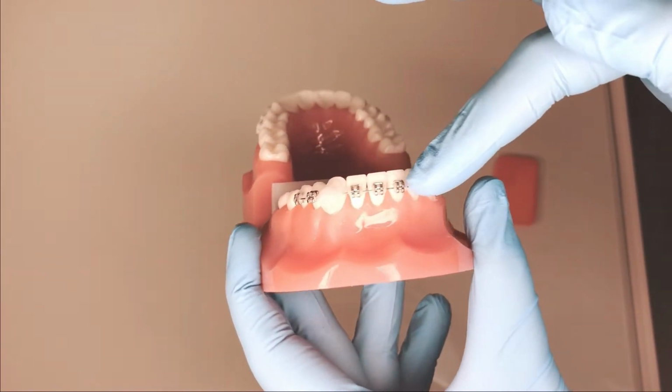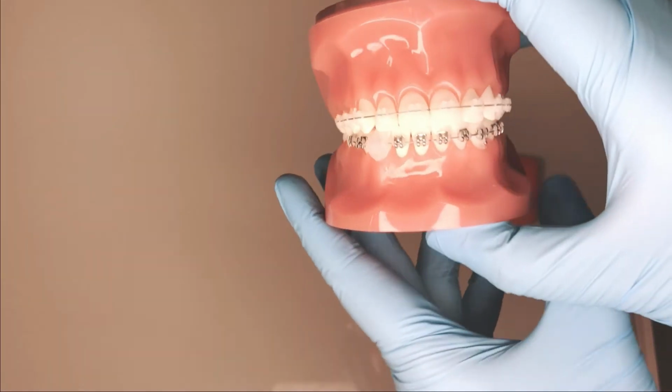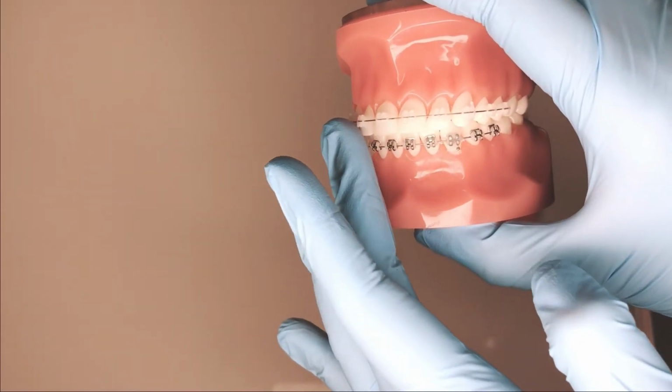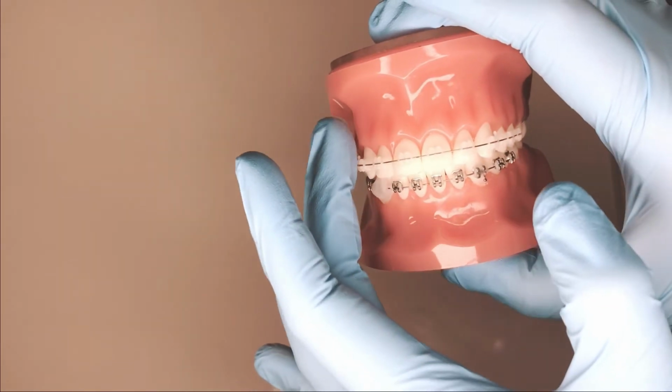Use it on all the braces that may be bothering you. You can leave the wax on during eating, but should remove it during brushing. If you happen to swallow some, do not worry, it is not harmful to you.